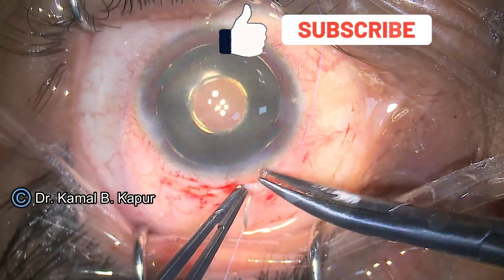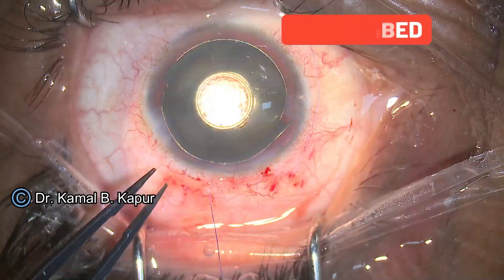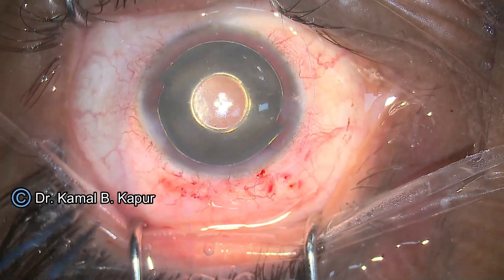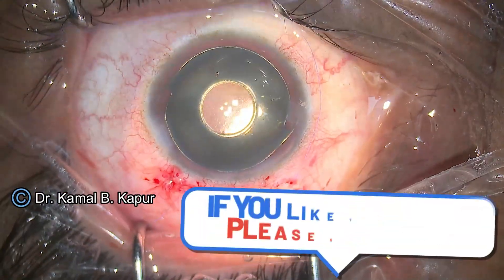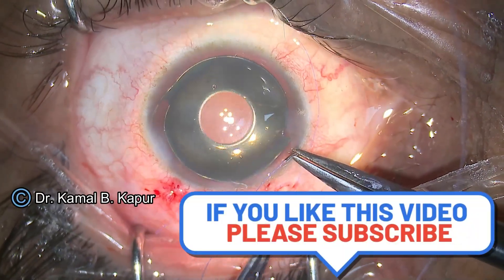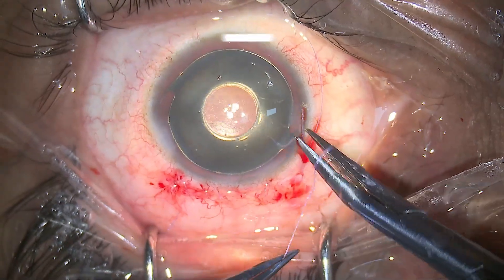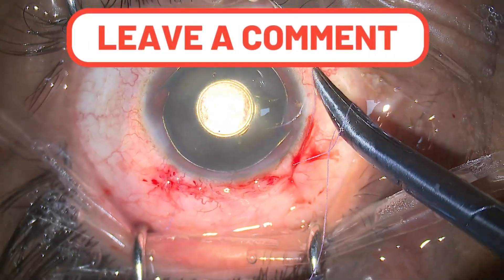We proceed to suture the conjunctiva with a 7-0 Vicryl suture in a shoelace pattern, making sure the wound is absolutely closed. The lens is absolutely centered. This patient did very well — he achieved 6/12 unaided vision and was extremely happy, and came back for second eye surgery after one week.